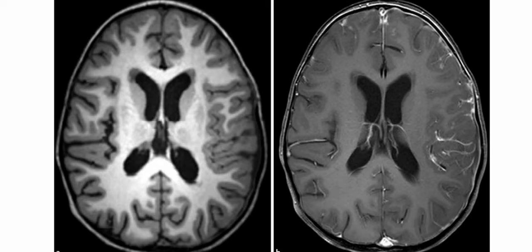The hypointensity, which is adjacent to the frontal horns of the lateral ventricles, corresponds to the regions of gliosis. So basically, there is nodular leptomeningeal enhancement involving the left frontal and left temporal lobes. So this is a case of leptomeningeal enhancement, and the top diagnosis will be meningitis, and other than that you can add neurosarcoidosis in the differential or leptomeningeal carcinomatosis and collateral vascular flow and subacute infarction.